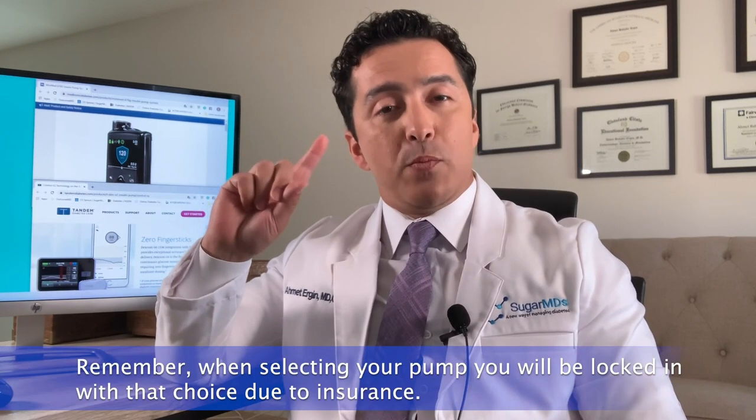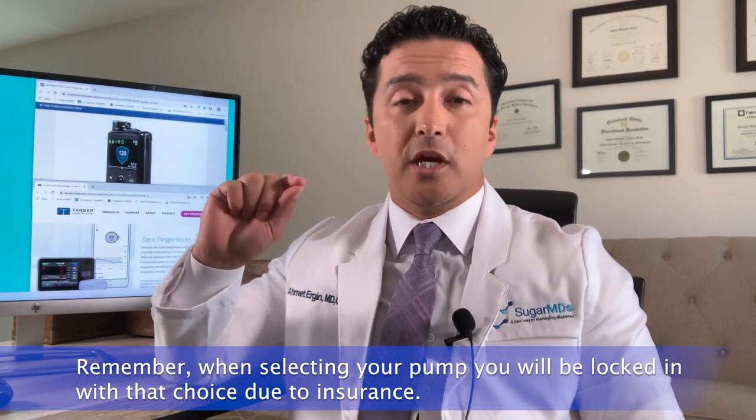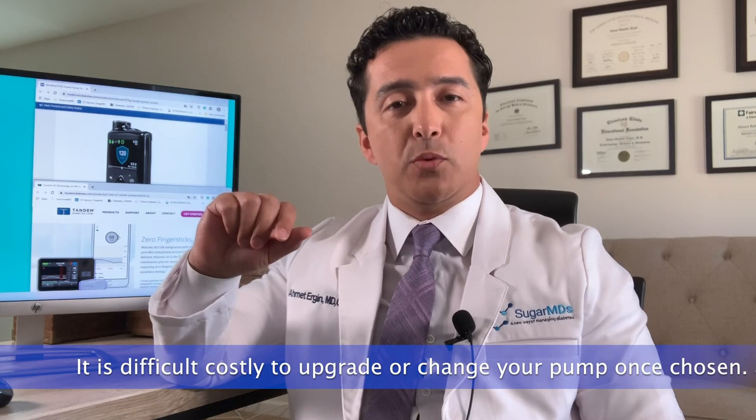Remember, when you get a pump you are practically stuck with it for a long time, so you better like your pump. If you don't, it will be difficult or at least costly to upgrade or change to a different brand.